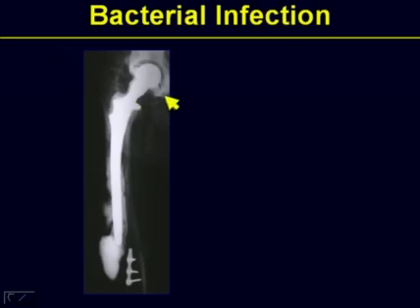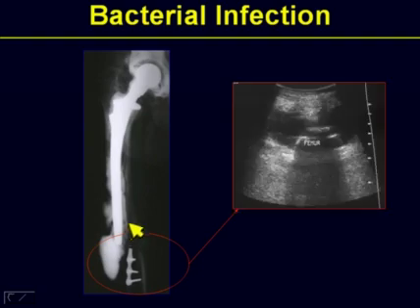For bacterial infections, as you could see in this prosthesis with chronic osteomyelitis and already a failed portion of it, notice that if you were to introduce contrast in the intracapsular portion of the acetabular femoral joint, some of it would trickle inferiorly into the distal portion. Therefore, it will behoove you to make sure that you check not only the hip portion, but also the distal parts.